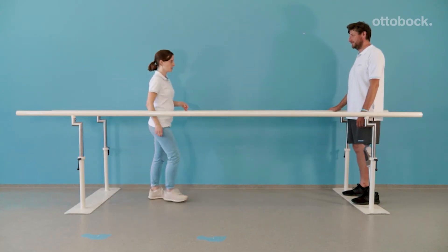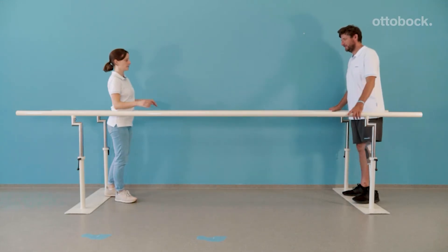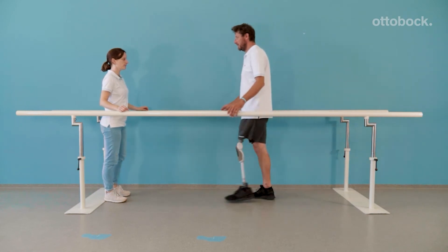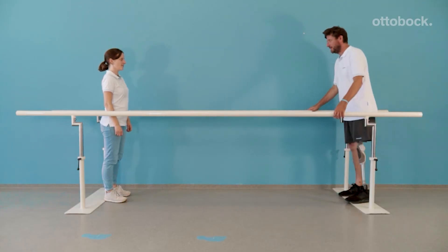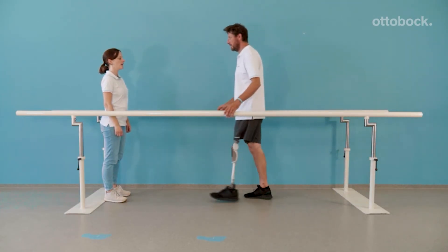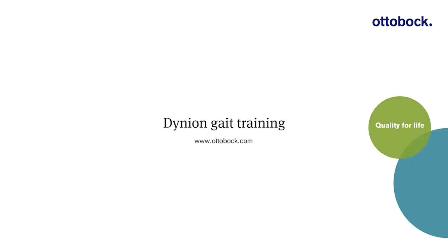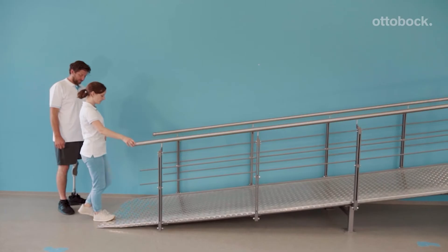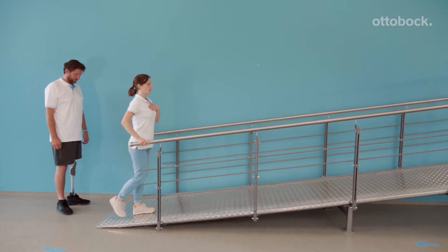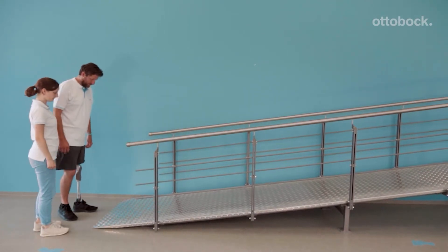In this exercise, our model learns how to slow down using the yielding technique to relieve the contralateral side. When practicing without holding onto the parallel bars, the amount of yielding is determined by his ability to bring the knee into extension. When walking uphill, our model makes sure he is initiating swing phase by using the hip flexor muscles. The therapist makes sure he does not circumduct or use a hip hiking motion.